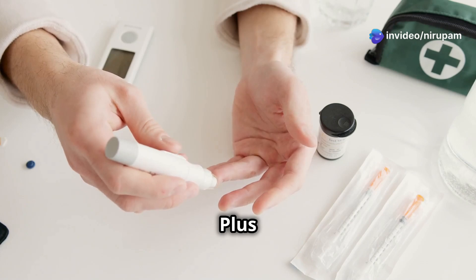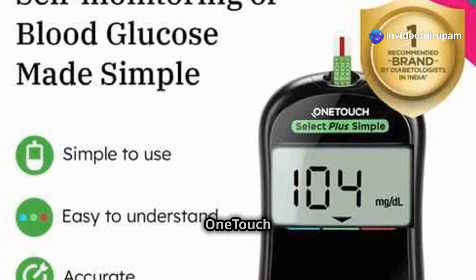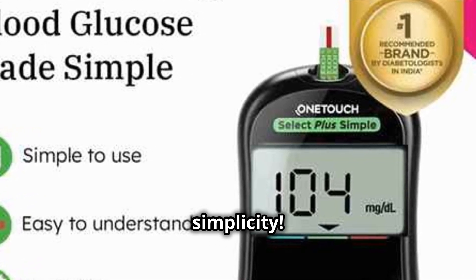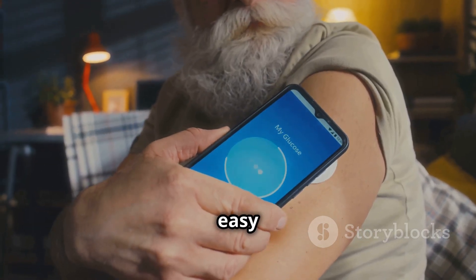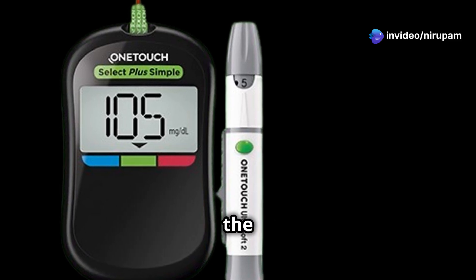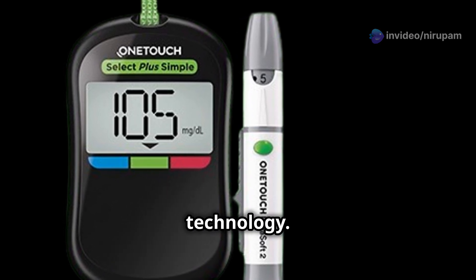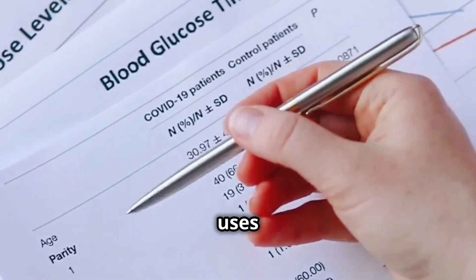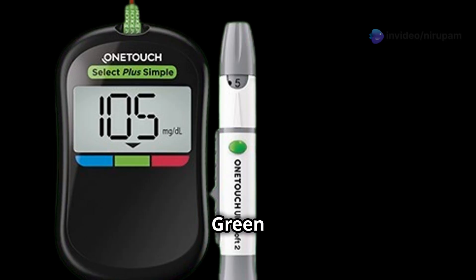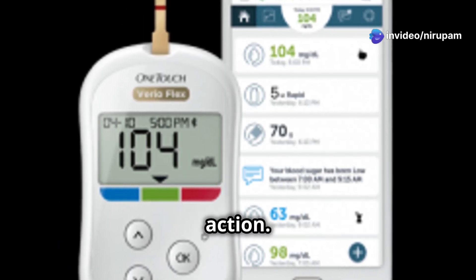One Touch Select Plus Simple — Simplicity at its finest. Next up, we have the One Touch Select Plus Simple, and this one is all about simplicity. If you prefer things straightforward and easy to understand, this glucometer is right up your alley. One of the standout features is its ColorSure technology — an innovative system using intuitive color coding to indicate if your blood sugar levels are within range. Green means you're good to go, yellow signals caution, and red indicates a need to take action.